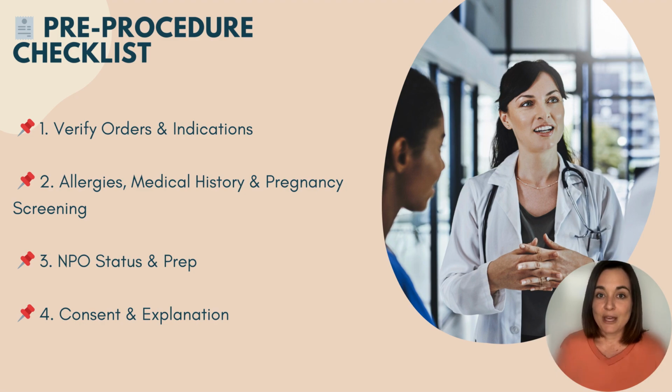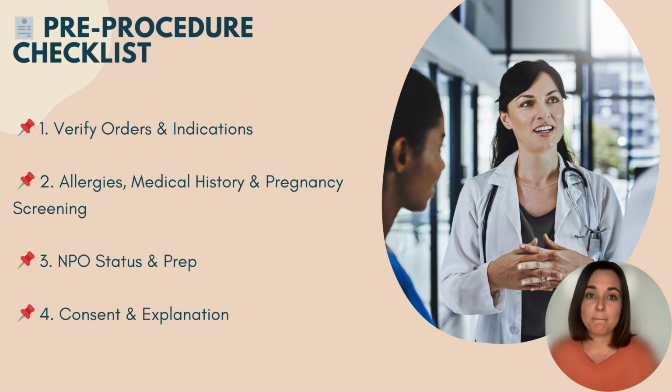Fourth, we have consent and explanation. Always explain the procedure in clear and simple language. Describe how the contrast will taste or feel. Tell them about positioning changes, compression paddles, and potentially after effects like white stools. If contrast will be administered, informed consent must be obtained, either written or verbal, per facility policy.